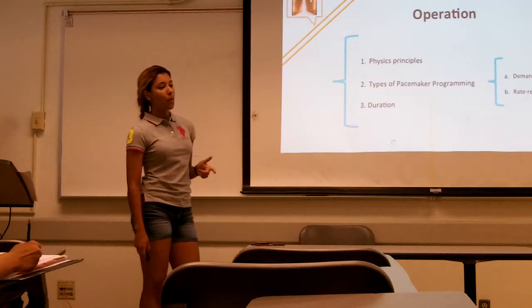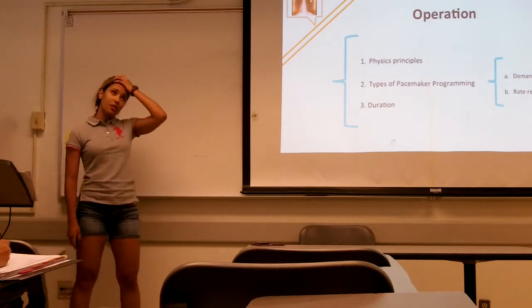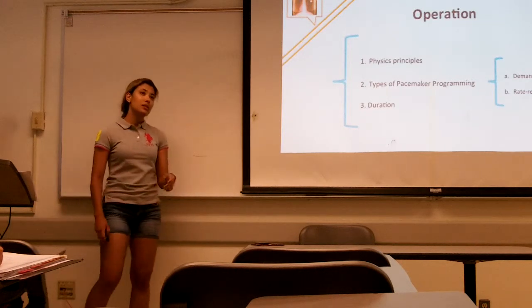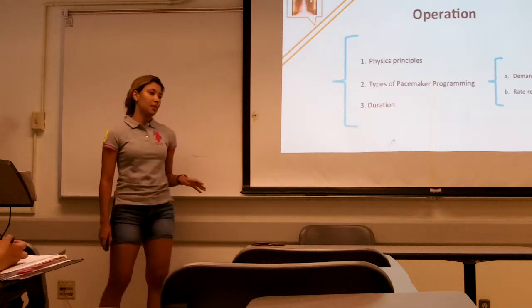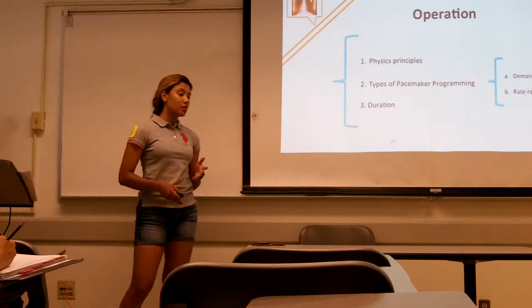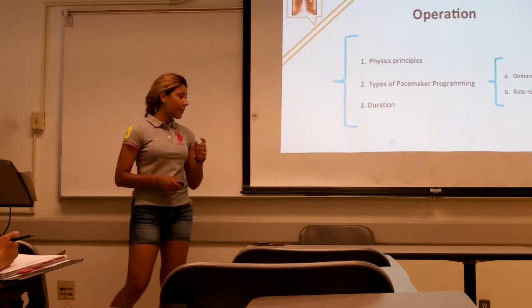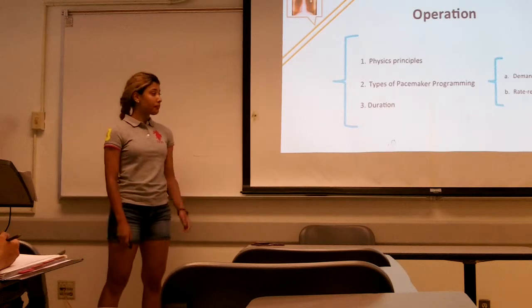Temporary or permanent. The temporary ones are frequently used in situations like short-term heart problems, such as heart attacks or heart surgery, or overdose of medicines.